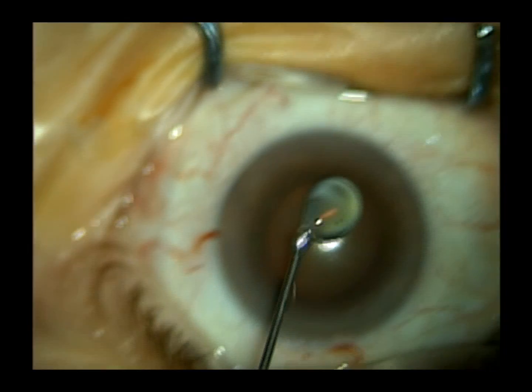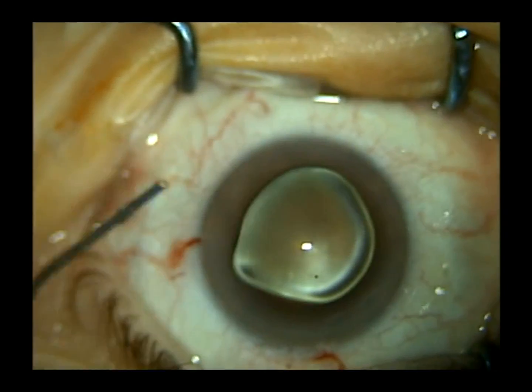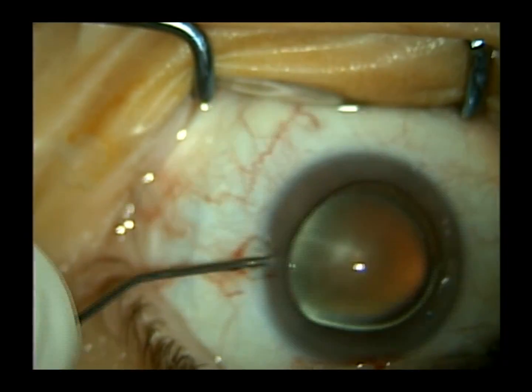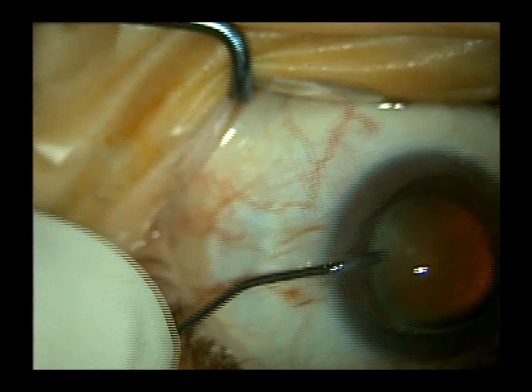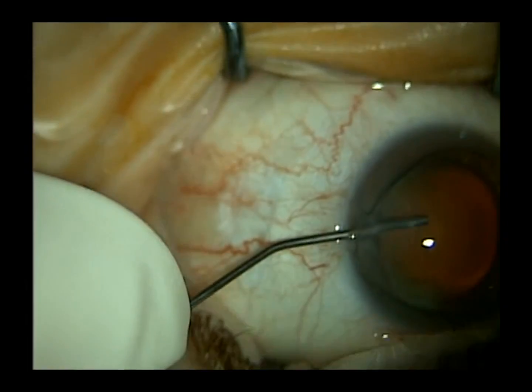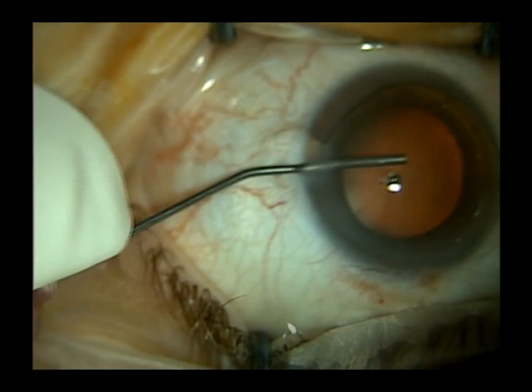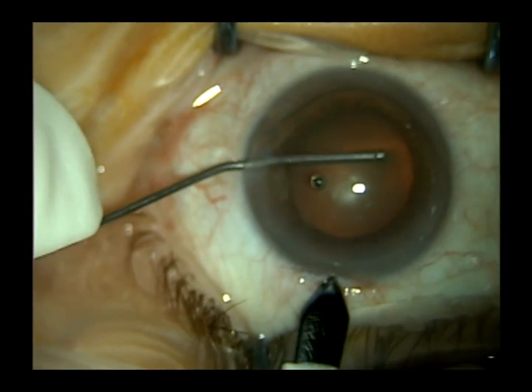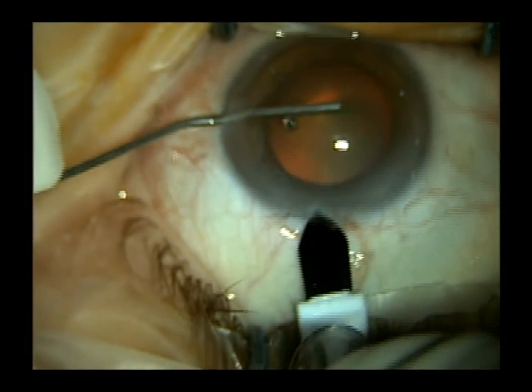So it's all done like most of my cases under topical anesthetic only. Patient sedated with oral Valium, 10 milligrams. They're awake, but they're comfortable. I have anesthetized the eye with topical anesthetic, and then I moisten the cornea with OcuCoat. I then firm up the globe with OcuCoat. I've already made my conjunctival peritomy, so I go ahead and enter the eye.